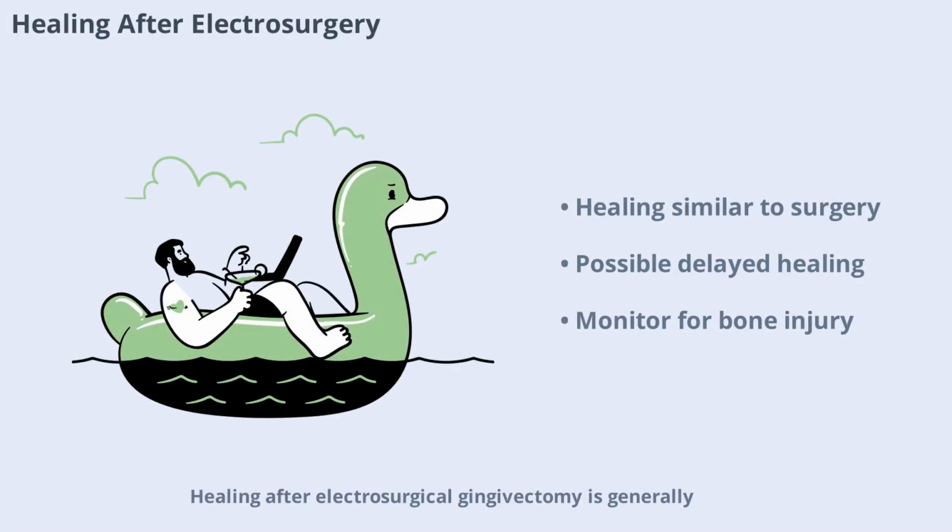Healing after electrosurgical gingivectomy is generally similar to that after traditional surgery. However, some studies report delayed healing, greater reduction in gingival height, and more bone injury following electrosurgery. Close monitoring and proper technique can help minimize these risks and promote optimal recovery.